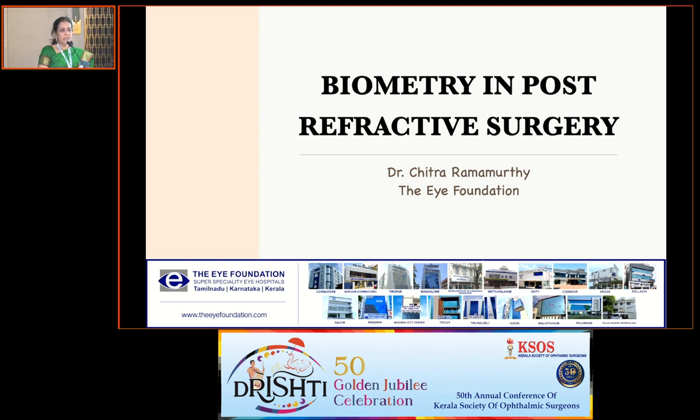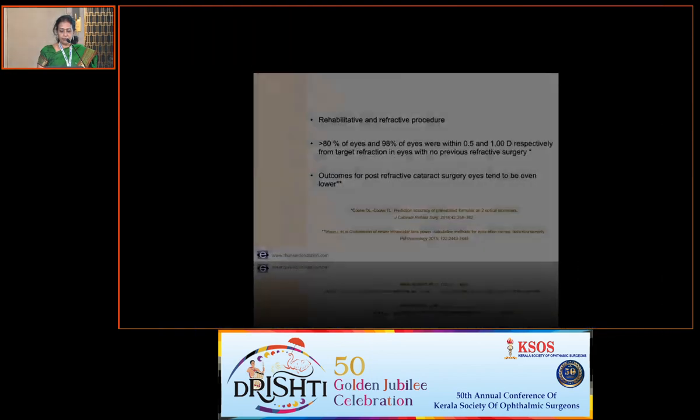So, biometry is actually a complex topic, and post-refractive surgery makes it a little more complex, because the challenge here is that these patients have enjoyed that visual independence before when they got the refractive procedure, and would want similar, and would even be ready for enhancements if they are stuck somewhere.